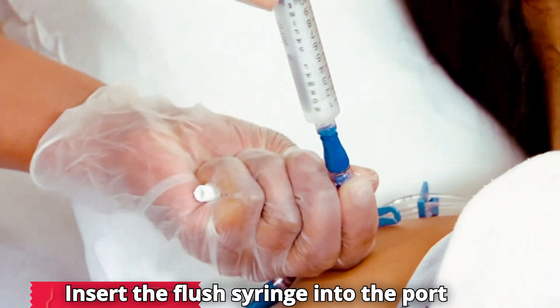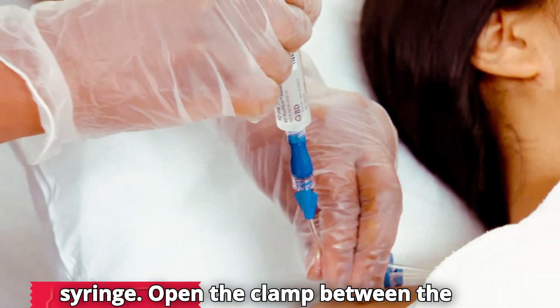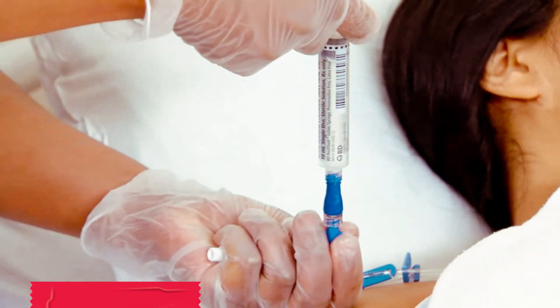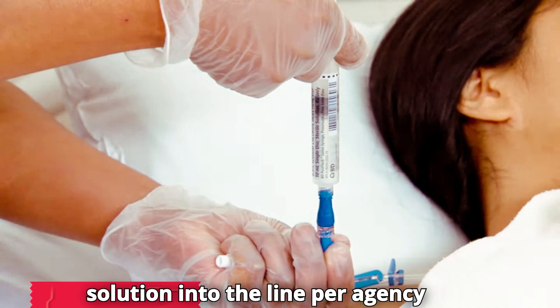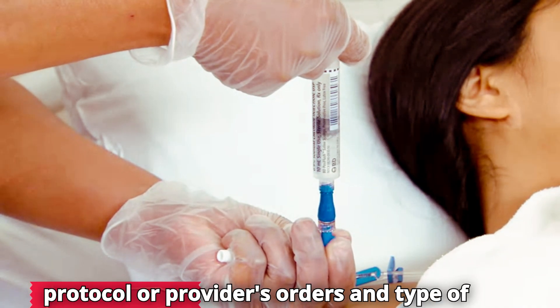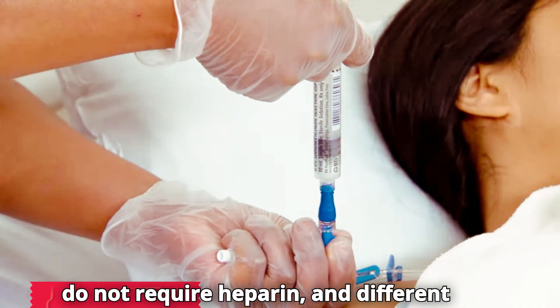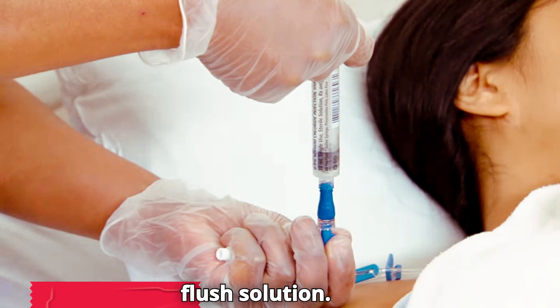Insert the flush syringe into the port using a needleless system or safety syringe. Open the clamp between the syringe and the patient. Inject saline or heparinized flush solution into the line per agency protocol or provider's orders and type of catheter. Some catheters do not require heparin, and different catheters require different volumes of flush solution.